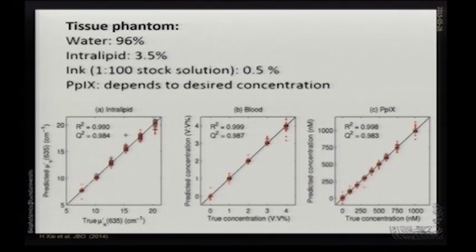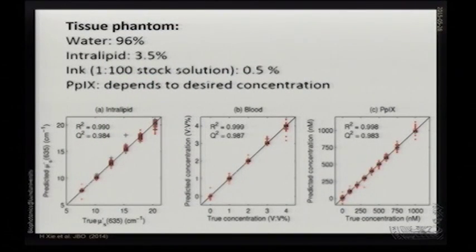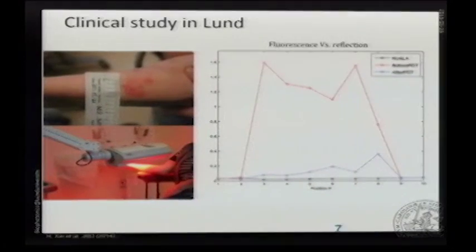So what we can then show is that if we have different phantoms, we had about 270 phantoms or so, with different optical properties, different absorbers, different scatterers, or different fluorescence concentration. As you can see, we can assess these concentrations rather well from these 25 measurements. If you measure correctly, with 25 channels you should be able to assess 3 different parameters out of that. And we can easily do that, quite robustly, it seems.